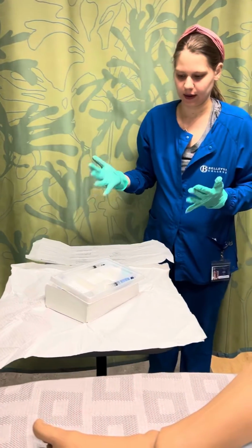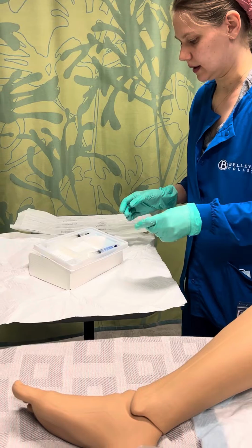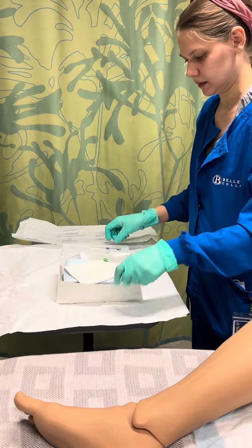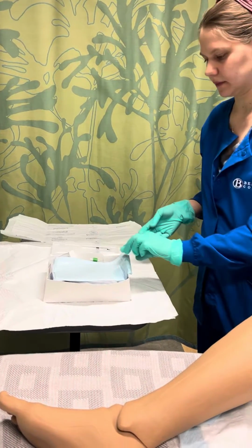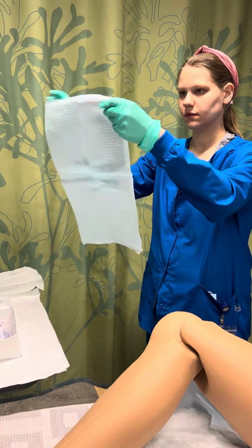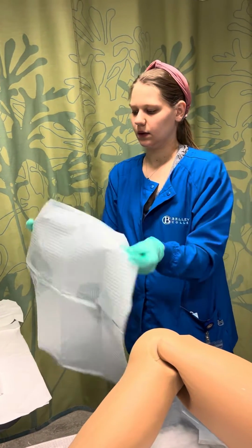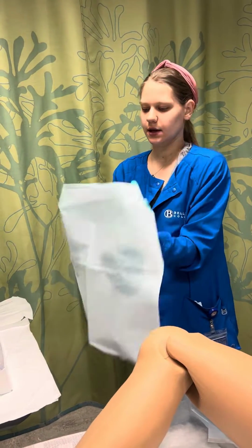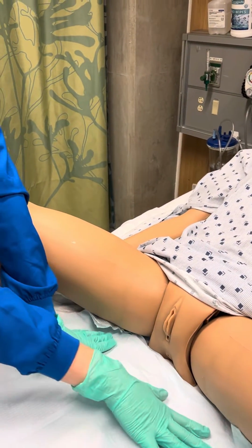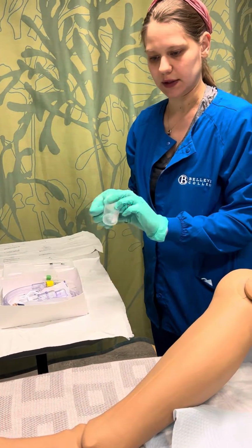Okay. And I put on my sterile gloves. And I don't need the fenestrated drape. I'm going to put this in place. I'm going to reach inside to protect my sterile gloves, and without compromising my sterile field, put that on the patient. Excellent. And I don't need a urine sample today, so I'm going to throw that away.